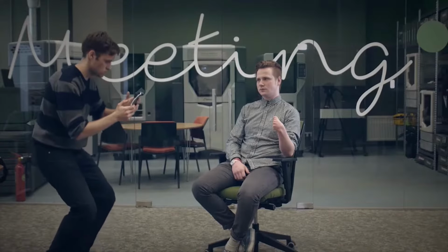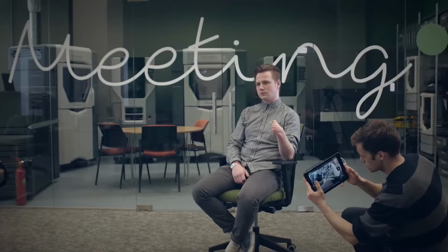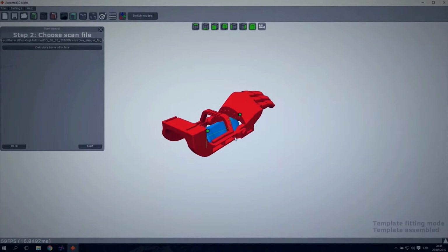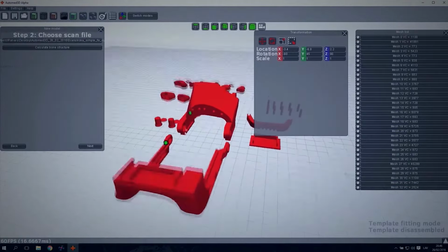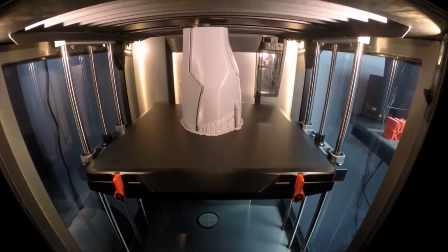weeks. Working with our second client, Janis, we tried to streamline the process as much as possible. We replaced manual measurements with 3D scanning. We used our previous experience to incorporate this 3D scan in the modeling process, thus decreasing the time needed. It took us only 2 hours to complete the digital manipulation. Another 6 hours were spent to 3D print and assemble the prosthesis.